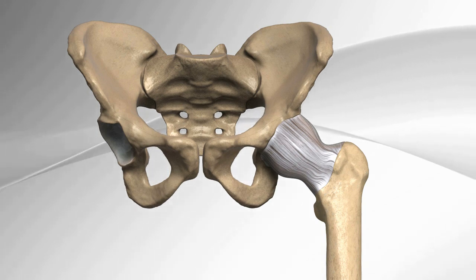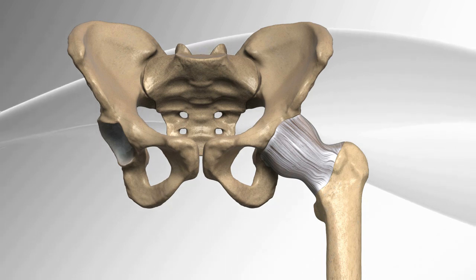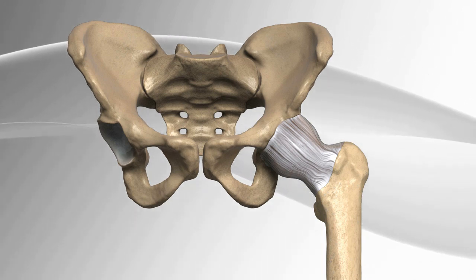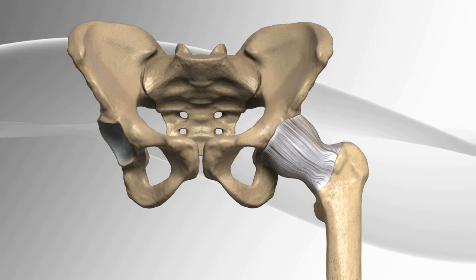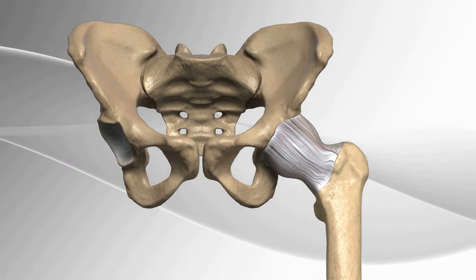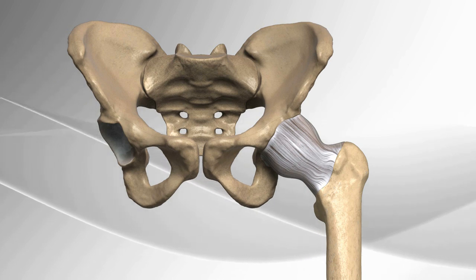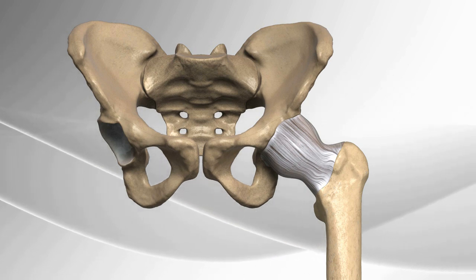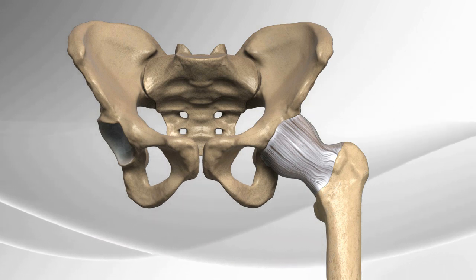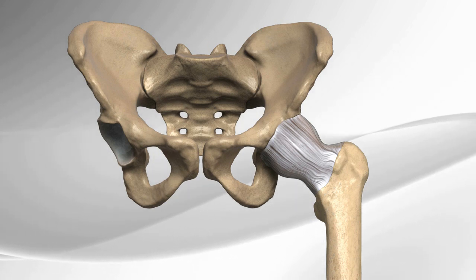In cam impingement, the femoral head is not round and cannot rotate smoothly inside the hip socket. A bump forms on the edge of the femoral head that hits the cartilage inside the socket and can lead to tearing of tissue. An arthroscopic femoral neck osteoplasty is the procedure for removing a cam bump on the femoral head and neck.